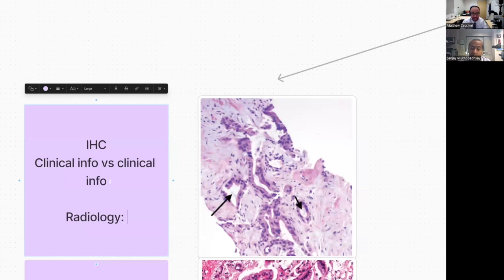Third, as you and I do a lot of lung pathology, we have a good sense of what is acceptable morphology for lung and what is not. If we see a colorectal met or a renal cell carcinoma, it immediately strikes us as odd.